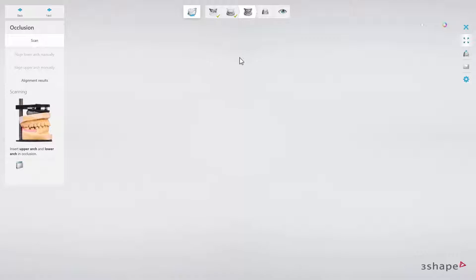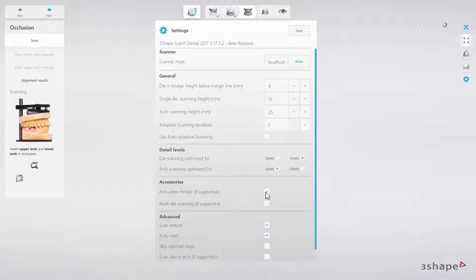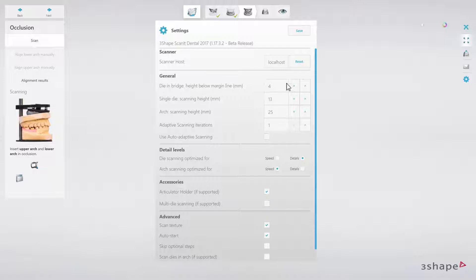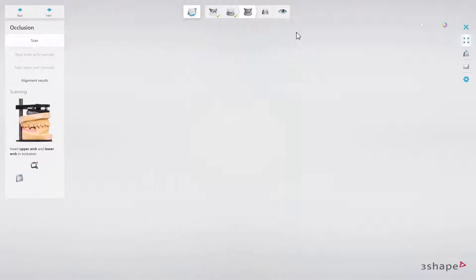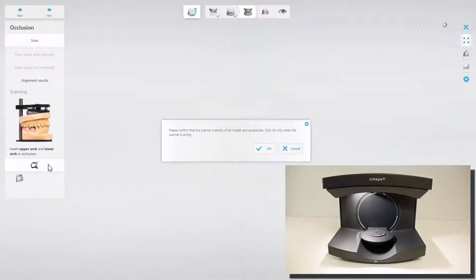You need to open the Settings panel and choose the Articulator Holder. The Articulator icon will now be visible in the Overview window. Now click Save and then click on the Articulator icon to activate this option. Note that the scanner should be empty without the Scan Height Adapter or the model with transfer plate. Confirm that by clicking OK on the pop-out.